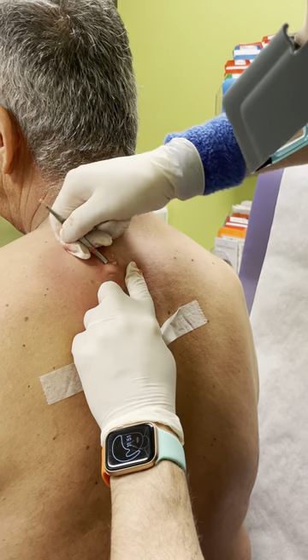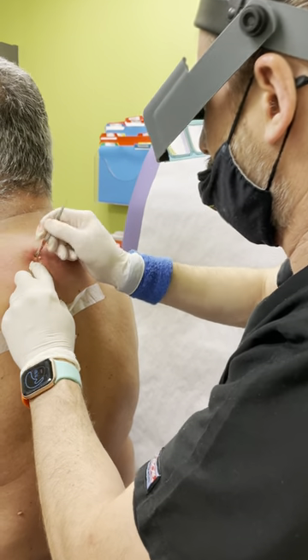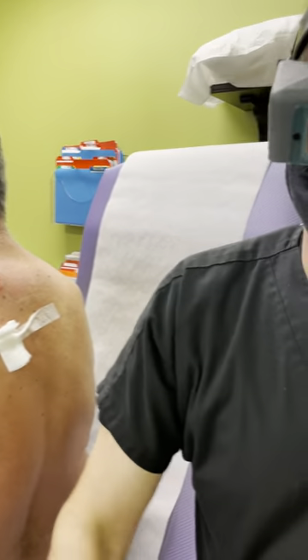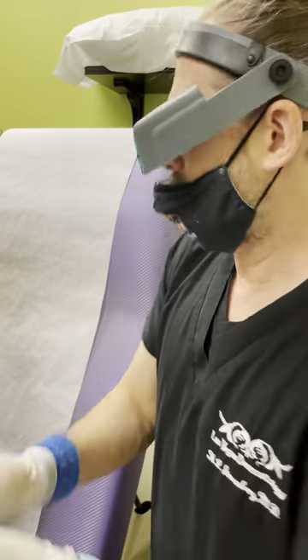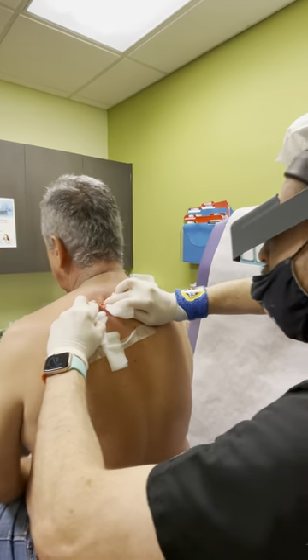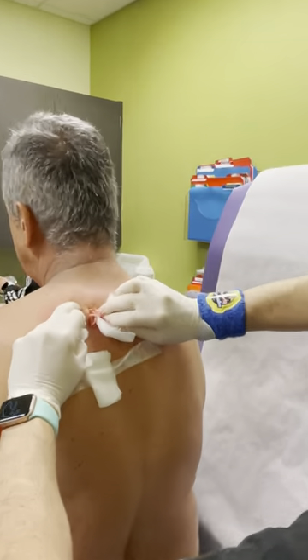This is the first time we've met, and he agreed to be filmed so that you could enjoy what we're all enjoying here at the Las Vegas Dermatology Fund. What this does is it loosens it all up, and when it's loose you can squeeze it out. I'm sure this will get me banned on TikTok.